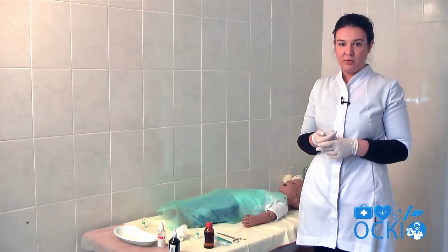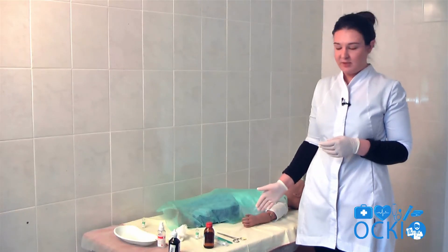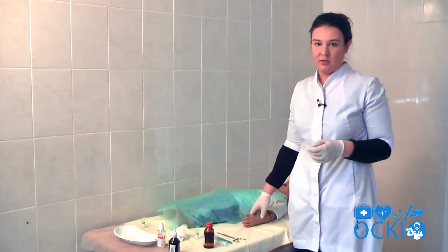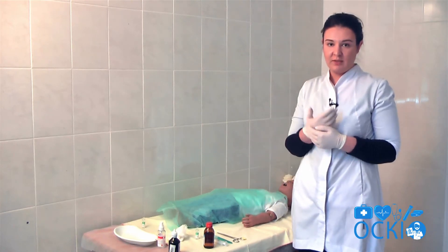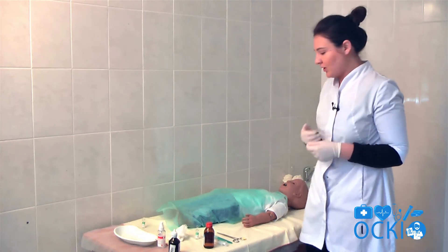Hello, now I will show you how to open and drain the abscess. At first, put on the mask, clean up your hands and put on sterile gloves.